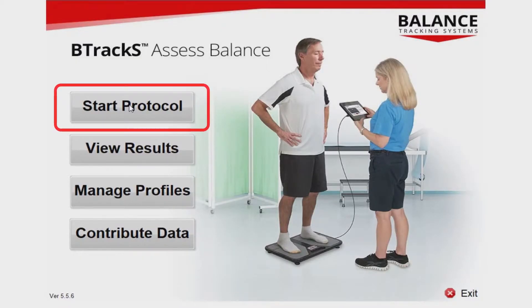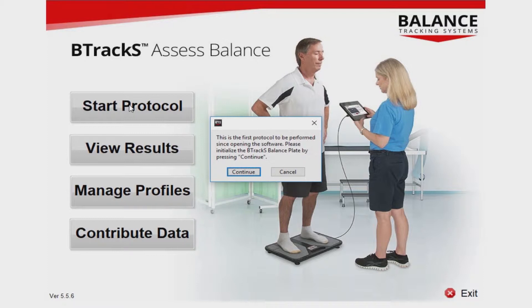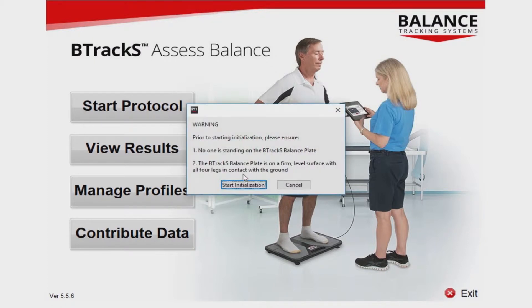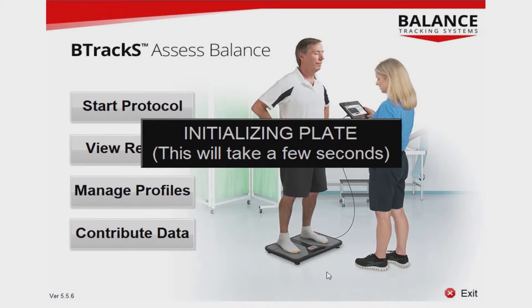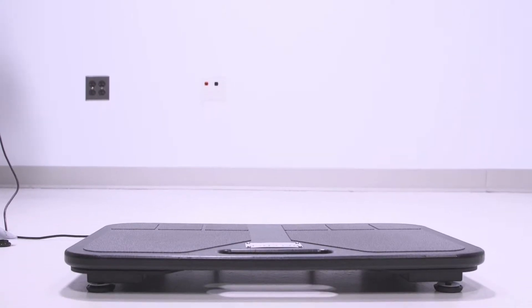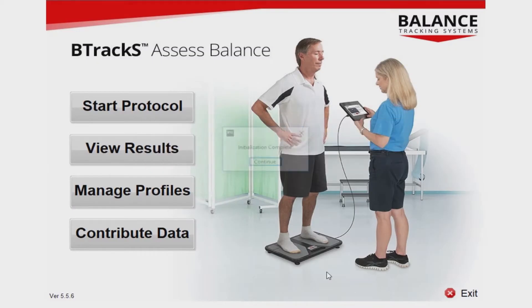On the software home screen, press Start Protocol to begin your session. Since this is the first protocol to be run since opening the software, a short five-second initialization of the B-Trax Balance Plate is necessary. Press Continue and Start Initialization. It is important that nothing is on the plate during the initialization process. Press Continue when initialization is completed.